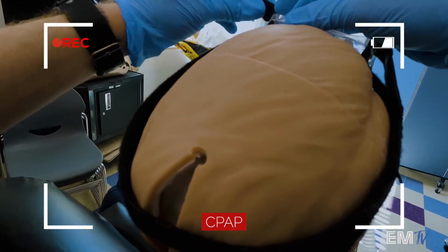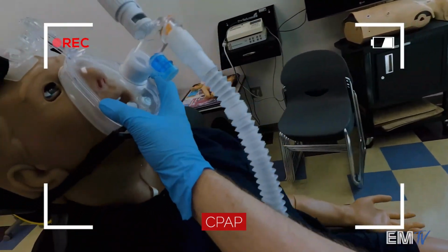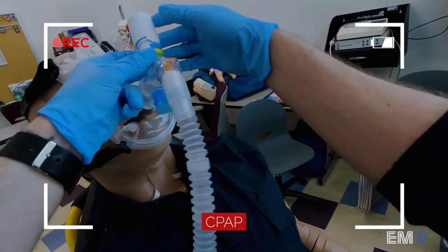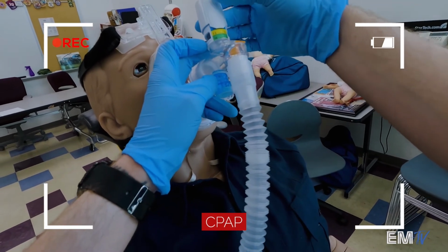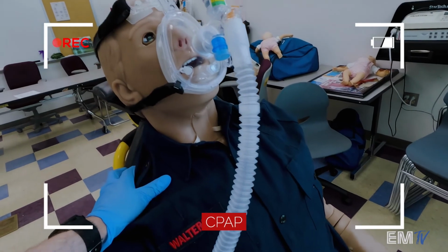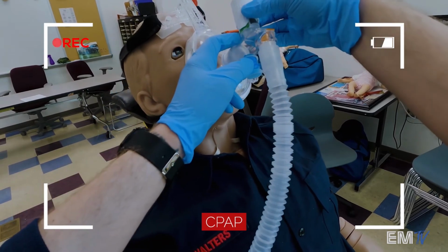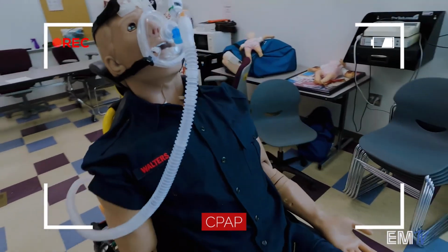Remember to provide coaching to your patient throughout the entire process of the application of the mask, as this may be a new and overwhelming experience. At this point, I can consider adjusting the PEEP depending on the patient's condition. The default setting of 5 should be used for bronchospasms in pediatric patients, and then the settings of 7.5 or 10 should be used for pneumonia, CHF, or pulmonary edema. Be aware that with some CPAP devices, changing the PEEP settings will increase the oxygen flow through the device, depleting your tank sooner.